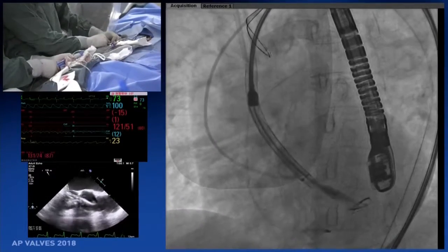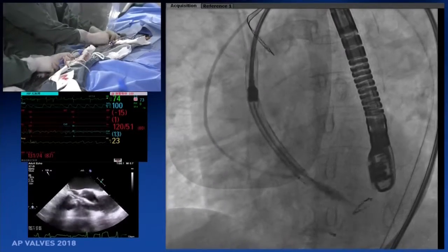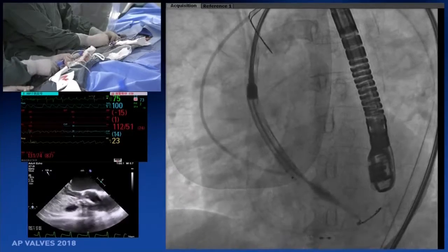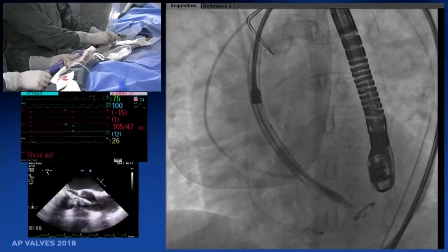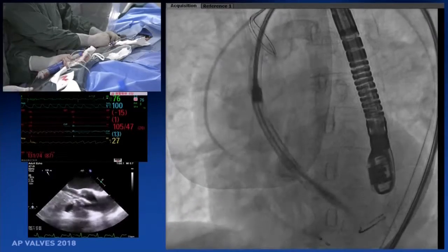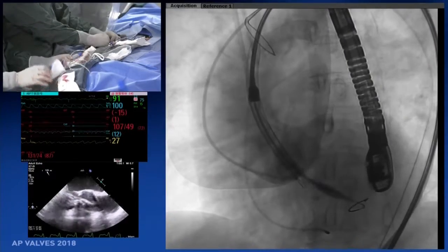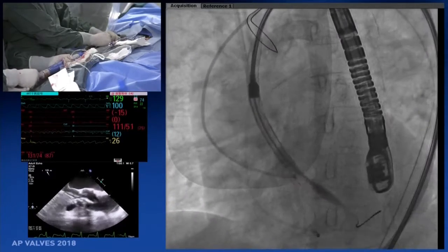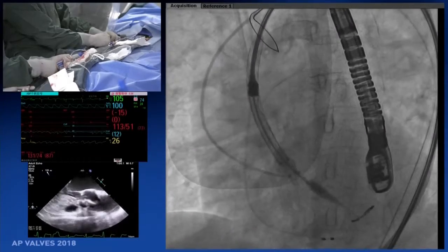So how do you think the initial deployment height looks? Is it good? Too shallow, I think that's right. But this is exactly the problem. The course is horizontal, and the valve is going up. Yeah, but now it's too high, and now the inflow part is bent. Too deep, I think it's too deep. We need to be a little bit shallower. Pull a little bit. It's okay.